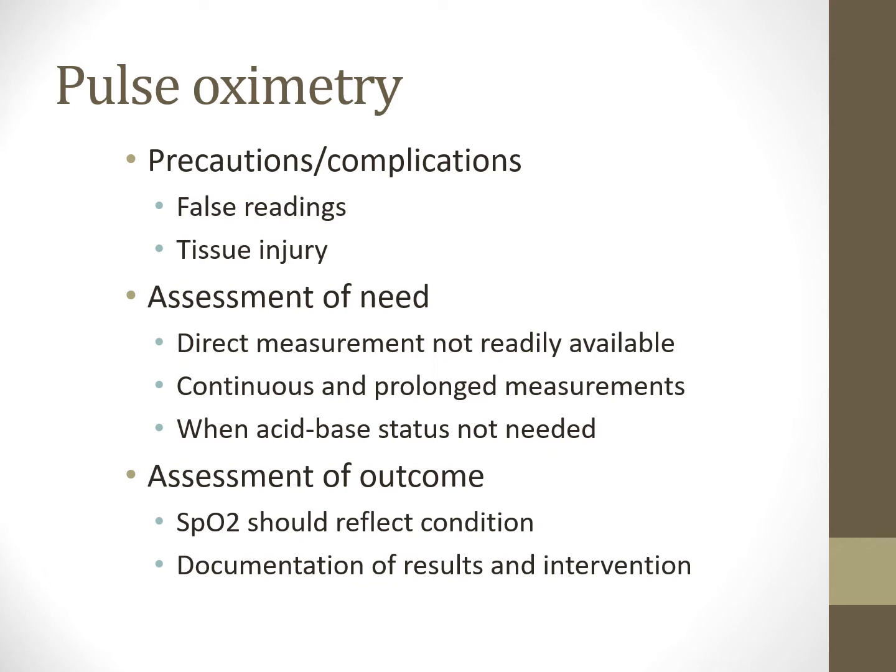Does the patient match what's going on with the monitored values? Something I talked about with the radiology students, I tell them, hey, if something's going wrong, you hear a machine beeping or alarming or anything like that, you're going to look at the patient first and see what's going on there and then work your way back to the machine. So I'm like, you might be the first one that actually catches that the patient's disconnected from the ventilator. Everybody else might be looking at the ventilator or looking at the monitor and not actually looking at the patient. So when something like this is going on, look at the patient.